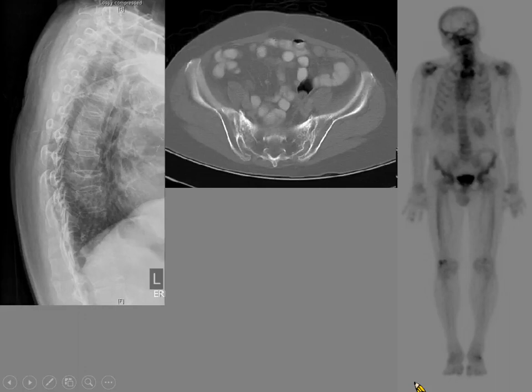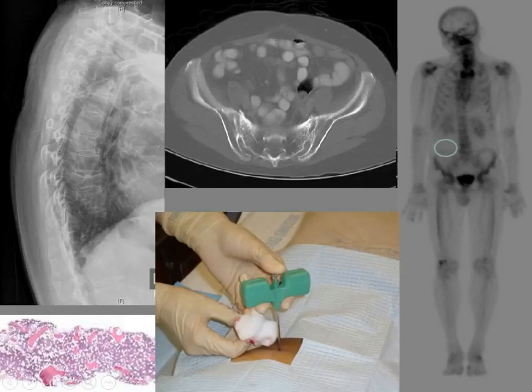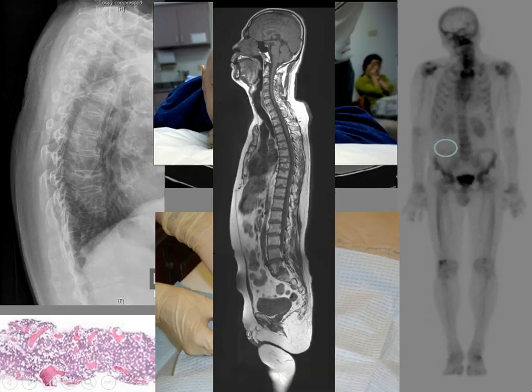At the opposite end of the spectrum, you can get a very specific and very sensitive diagnosis by performing biopsy, but obviously this is an invasive procedure, it's not a very comfortable procedure, and it's not something that you can do on a regular basis. So practically, MRI affords us the best modality for assessing marrow disorders.